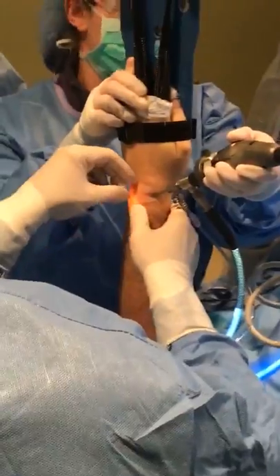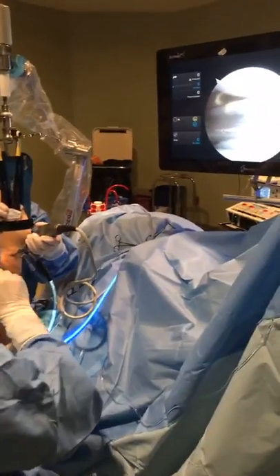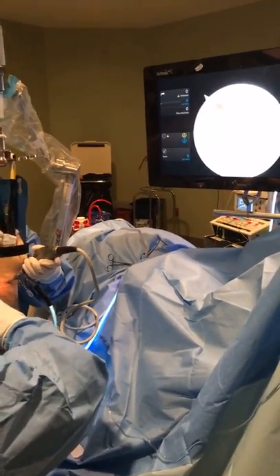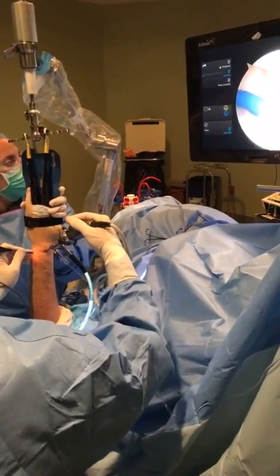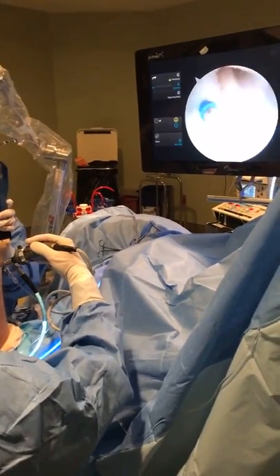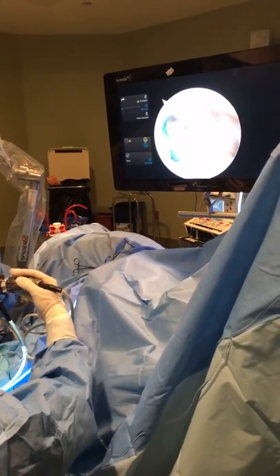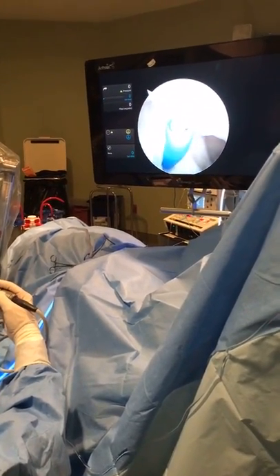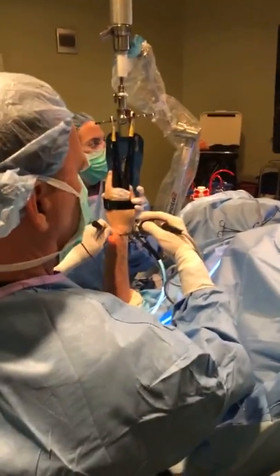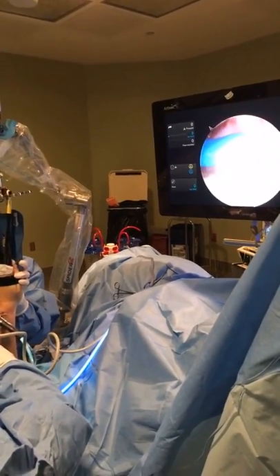Oh, it's my fault, I had opened it. Turn it down a little bit. I don't want the wrist to blow up. Okay. Hold that there. Tighten this up a little bit here. That's the part we're going to repair, so I'm not going to do that. But over here, this is pretty angry here.